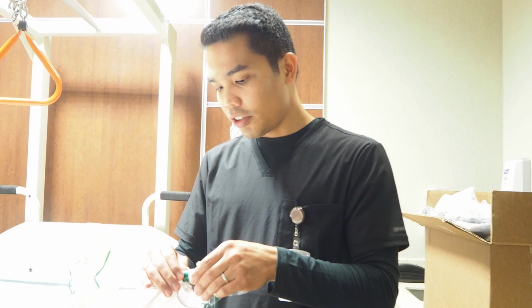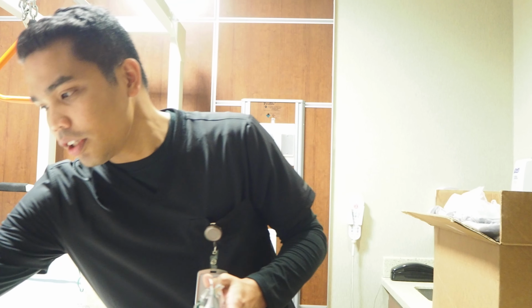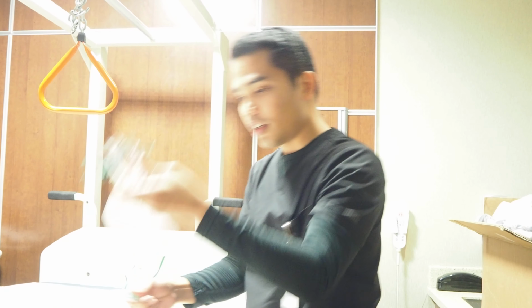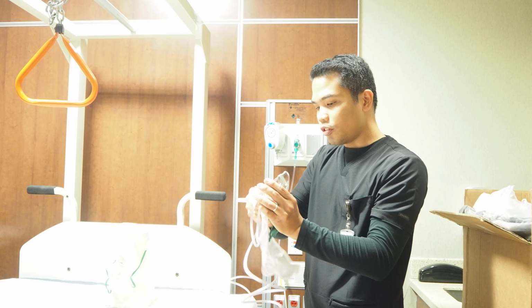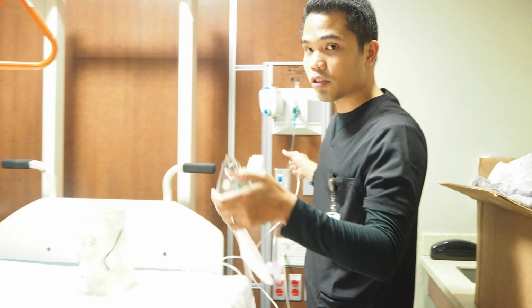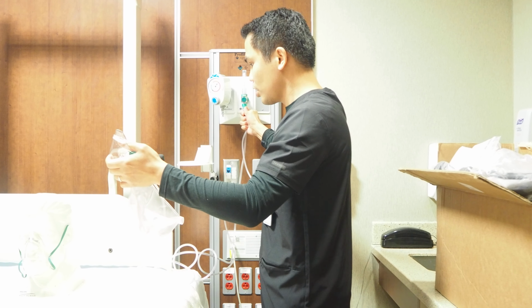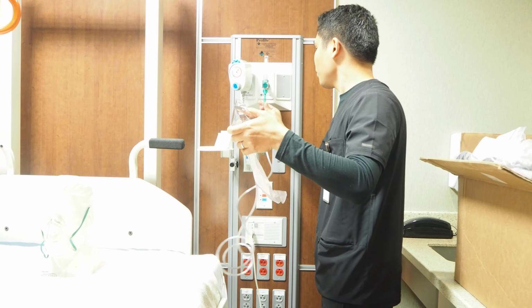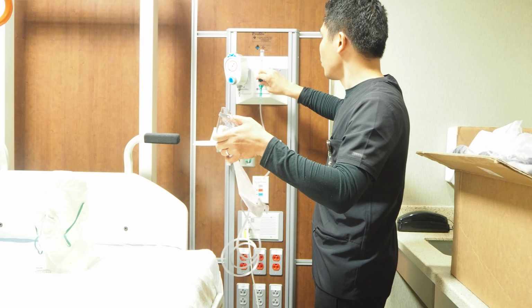So with the non-rebreather mask, the patient would not rebreathe any CO2. So with this, I always make sure that I have the non-rebreather in place in here, just to let the patient not rebreathe any CO2 because the patient was recently diagnosed with COPD. So for that, I have to turn this one off, and then hook it up with a non-rebreather mask, and then set it with the appropriate flow.